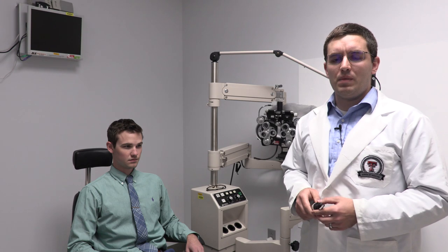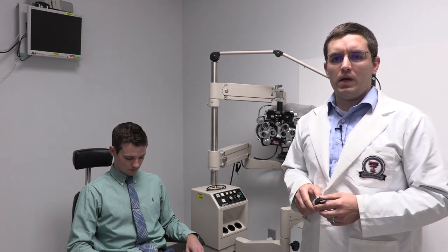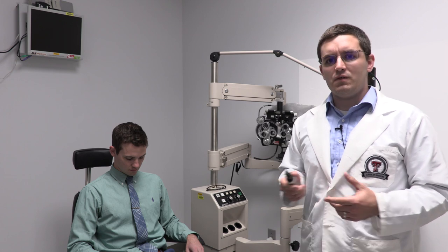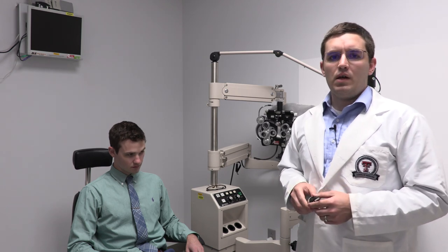Being able to estimate the depth of the anterior chamber with a pen light is a quick and straightforward way to assess a patient in a case of suspected acute angle closure glaucoma. We will now demonstrate how to do this.